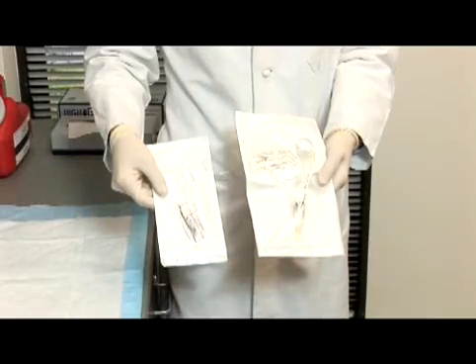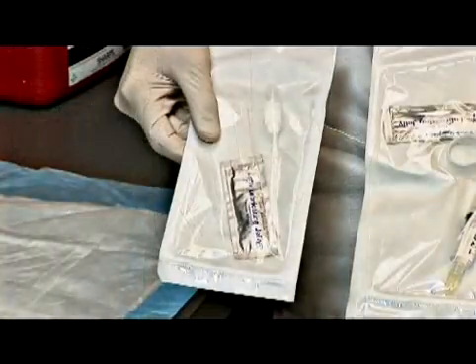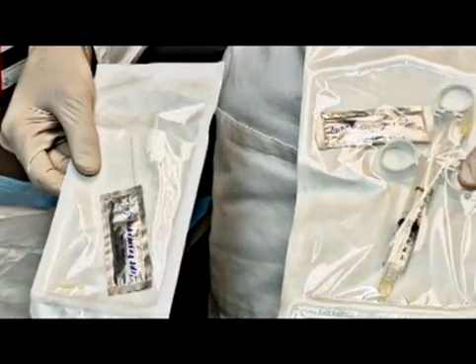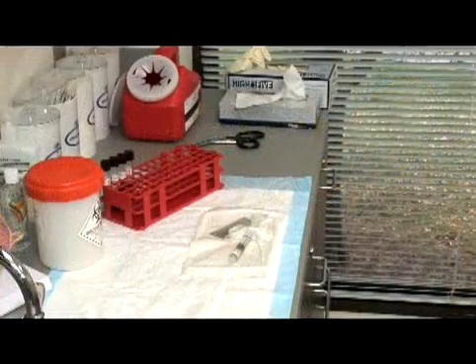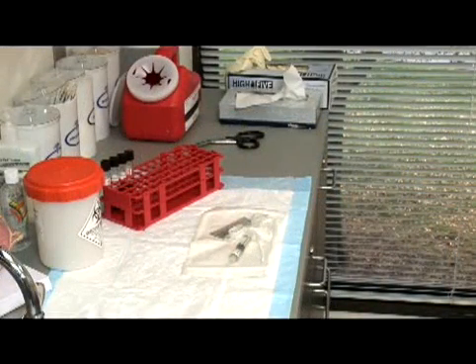When collecting a nasopharyngeal aspirate, you'll need a bulb style aspiration kit or syringe style aspiration kit. Once you have the necessary supplies on hand, you can collect the specimen.